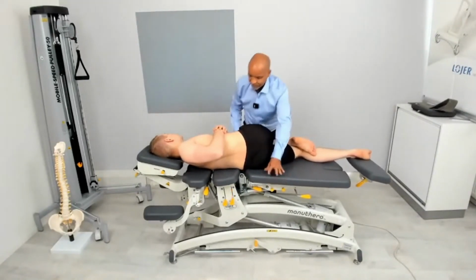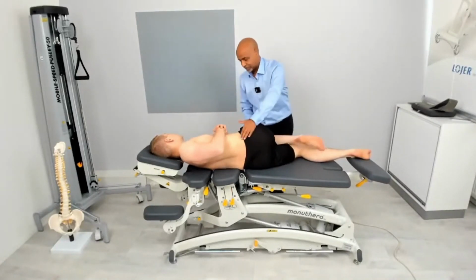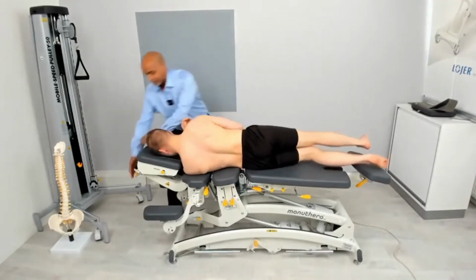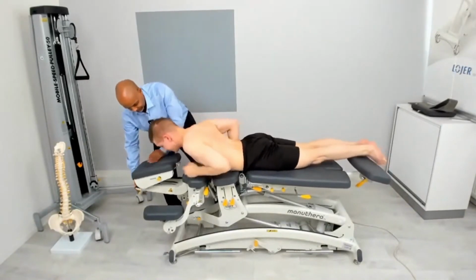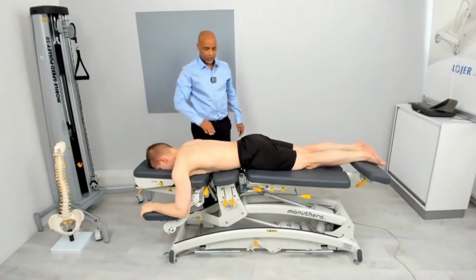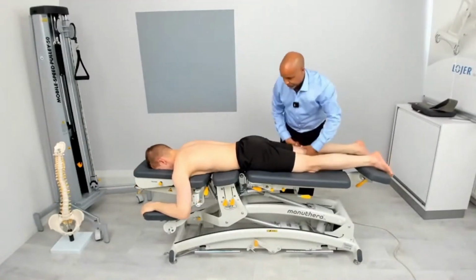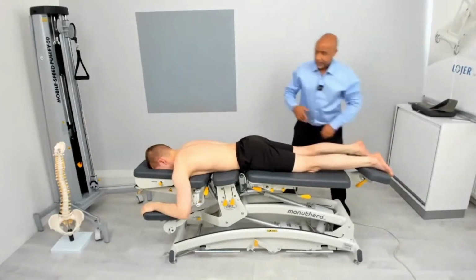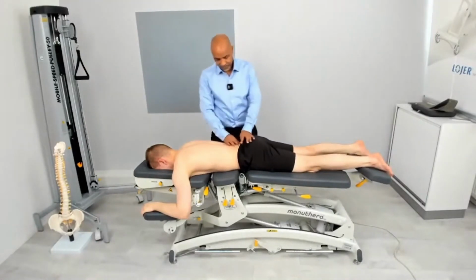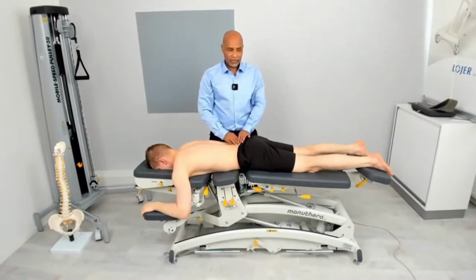Now I will ask the patient to go back to his stomach. Okay, back to the stomach. Let's just make sure again the position is correct. Then from this particular angle, I need to think about what if the patient has arthritis in those facet joints.